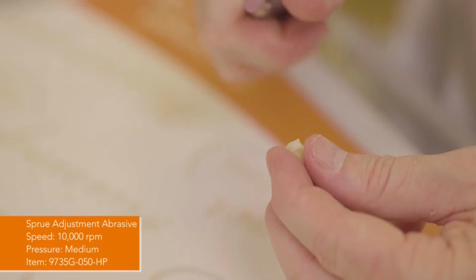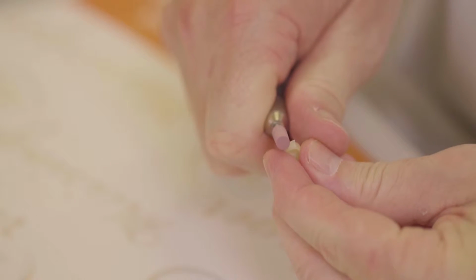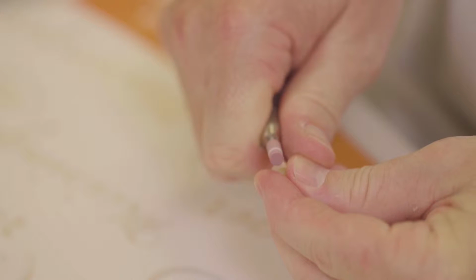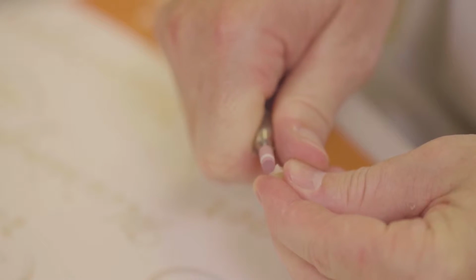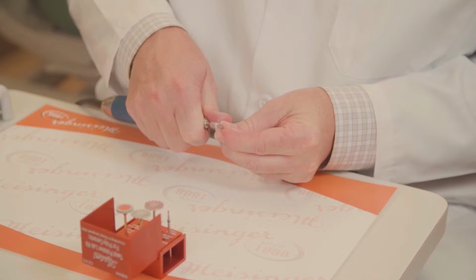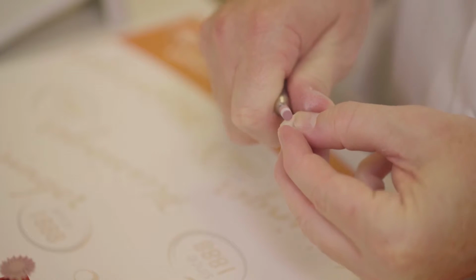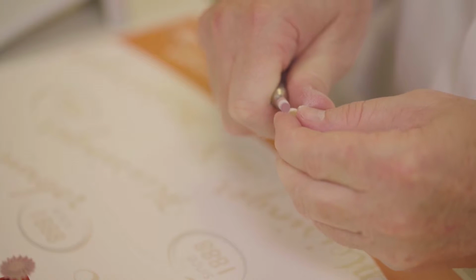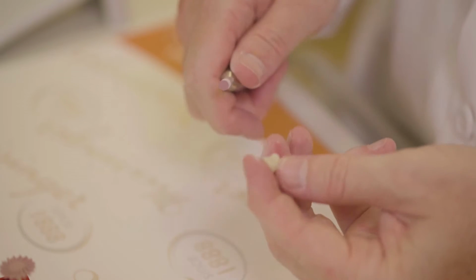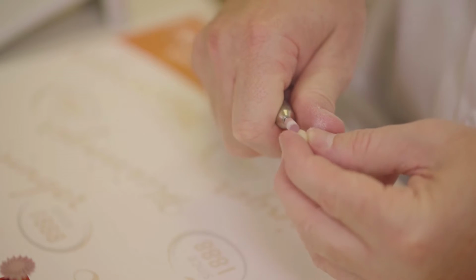The material we're going to be polishing is the Vita Enamic. What we're going to do first is we put on the sprue adjustment stone. We're going to put that on and we're just going to go in and remove the sprue very carefully. We're just going to come in here and let it work for us. Just take a few seconds to remove that. Okay, once we have that done, I'm going to round my marginal ridge like I've done in the past. And believe it or not, we're done using that.